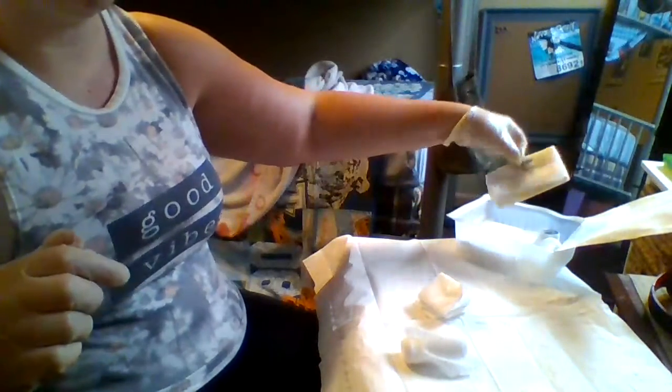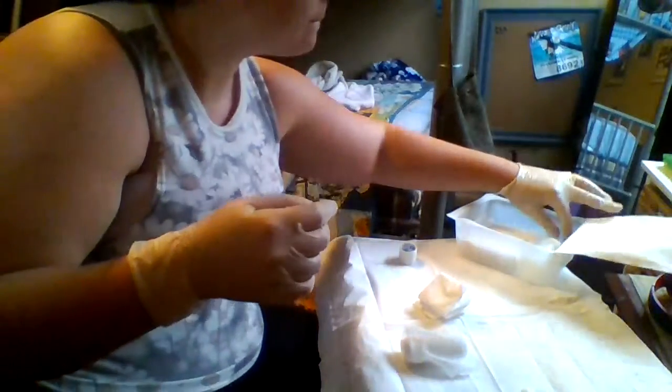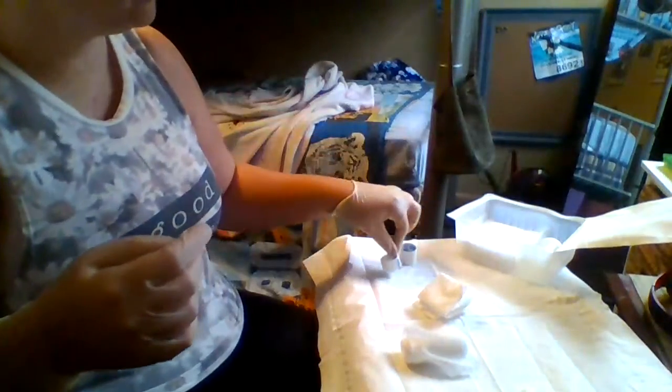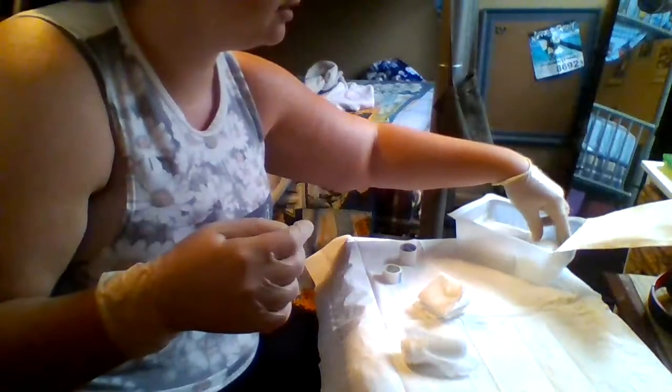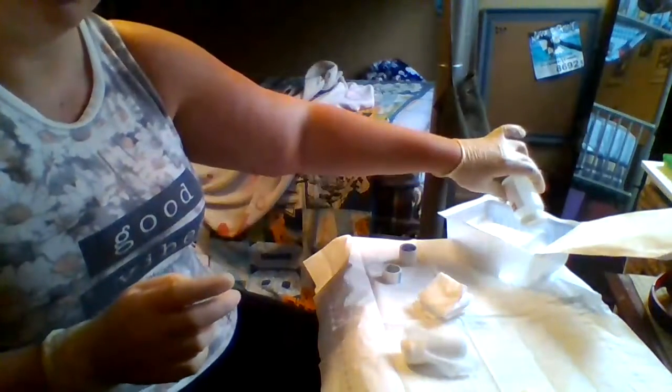Here would be my sterile gloves that I already put on because these don't really fit me. You don't want to put your back to the sterile field either. And then I have some normal saline right here, and I would pour this into my tray.